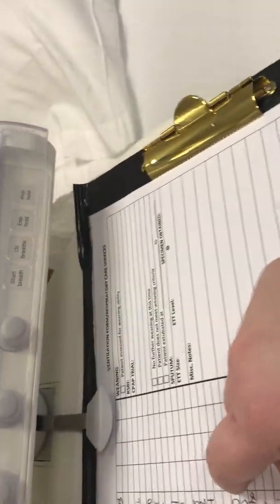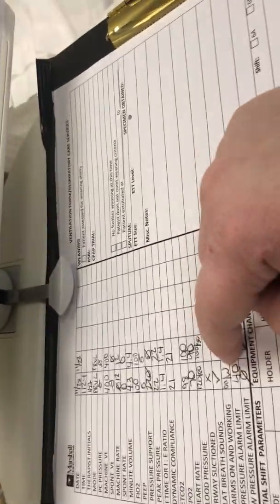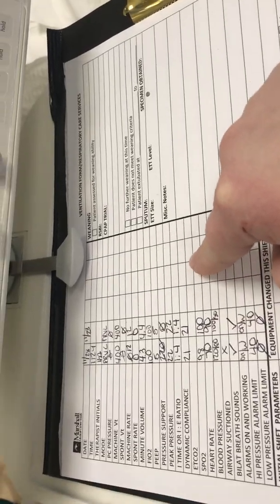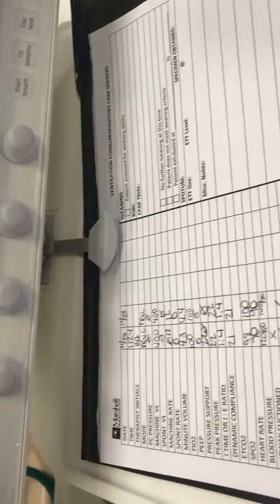Then I'd look at my patient vitals: the end-tidal CO2 machine for that, the SpO2, the heart rate, the blood pressure. If I suction the airway that time, I'd check mark it. I already did my assessment, so I'd check mark that I heard bilateral breath sounds. I'd check my alarms, make sure they're on and working.